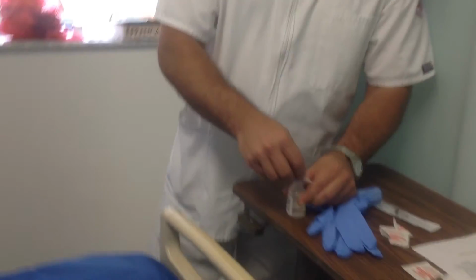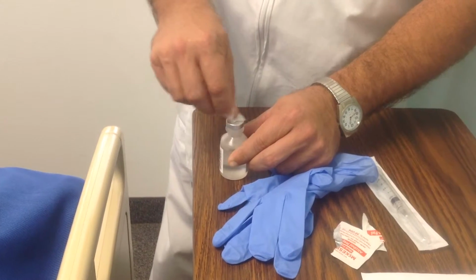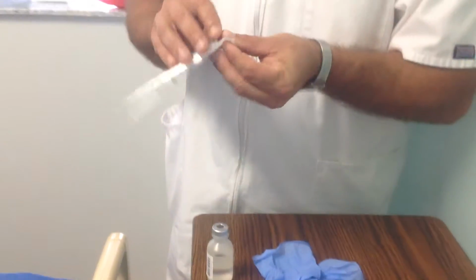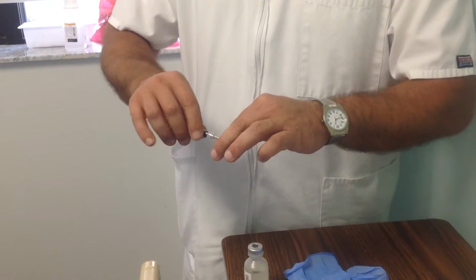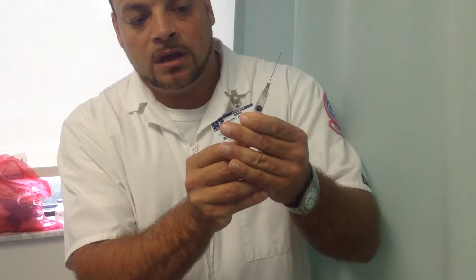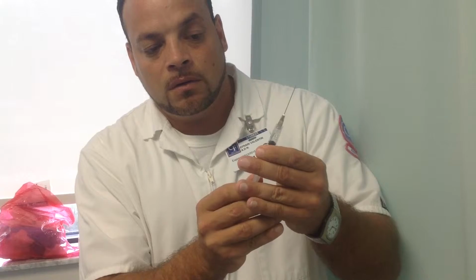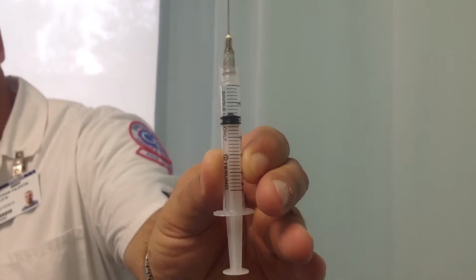I'm going to start off by wiping my med bottle. And we're going to need 0.8, so we will draw 0.8 of air.